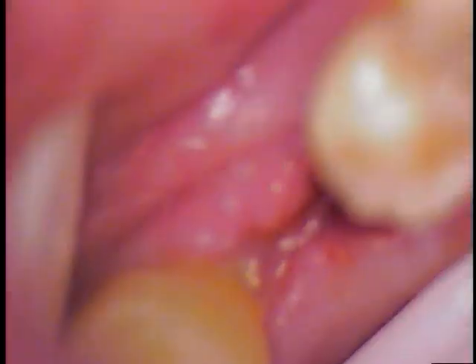I've got to do a quick check around the rim of this. And so I'm real close to finishing here. All right, so this is Dr. Jerry Cuomo. I think we've made a nice successful case here, but I've got to get back in there and just finish it up. So end of the clip, and we'll move it on.